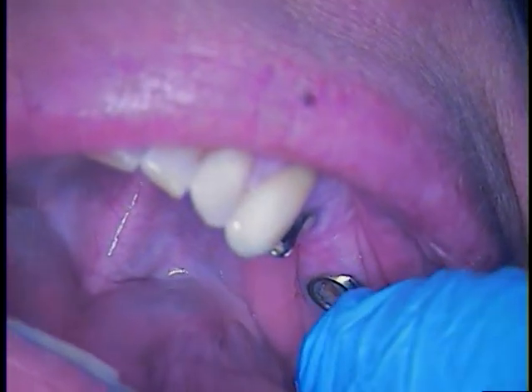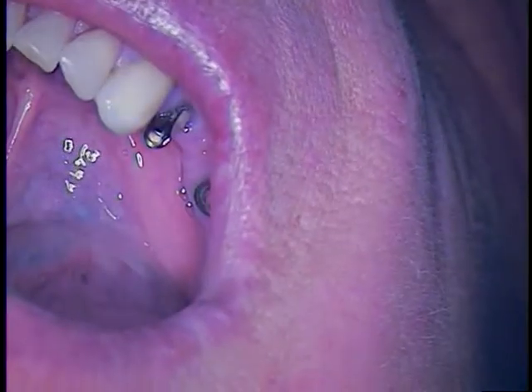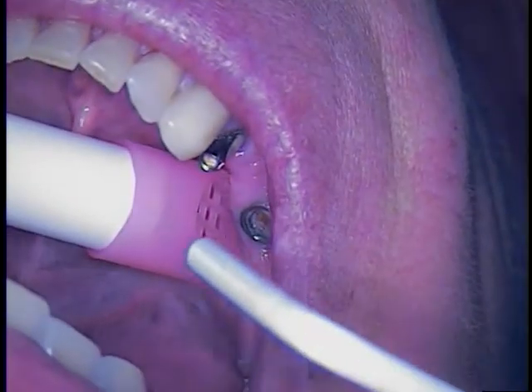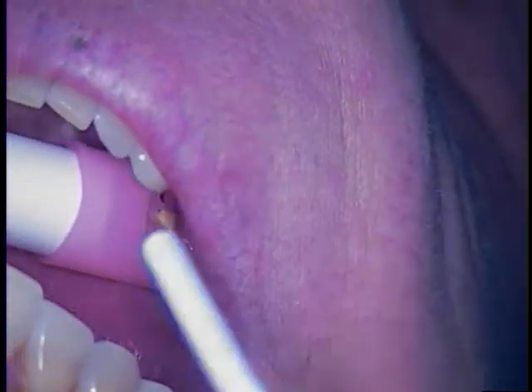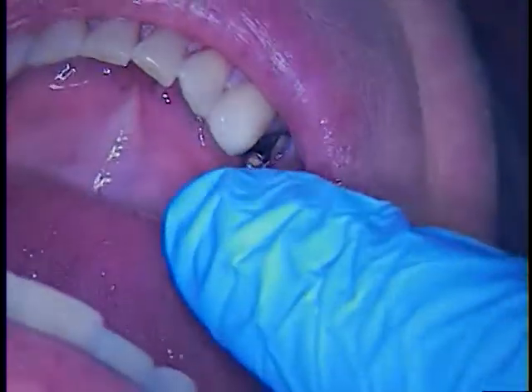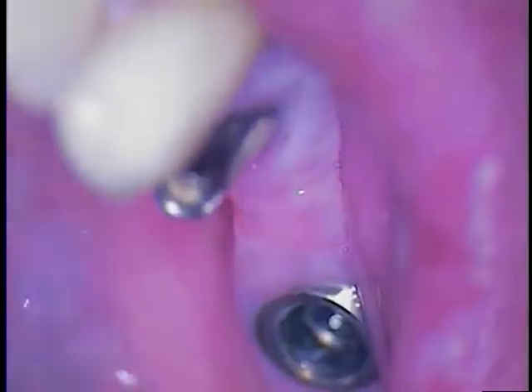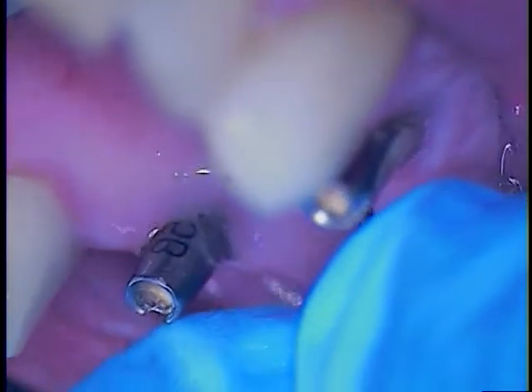This is a recent bridge according to our patient. I'm going to reduce the magnification. We're going to rinse out this area first — there seems to be an accumulation of food. The anterior abutment is intact, and we're testing for mobility. The anterior abutment right now does seem to be moving, but it looks like it is a standard angled abutment. We know it's a 15B — 15 Boy abutment.